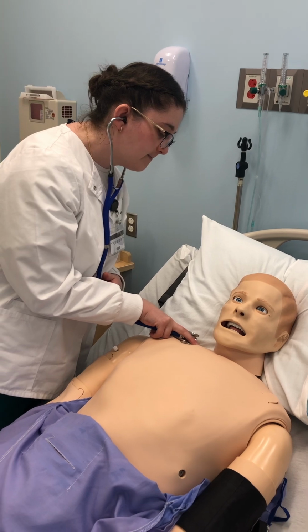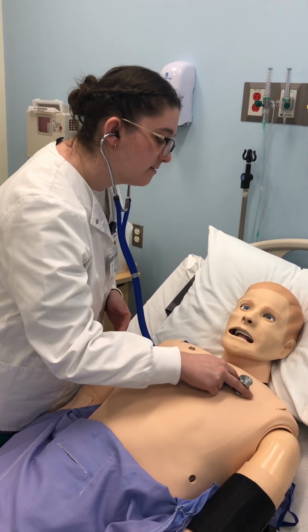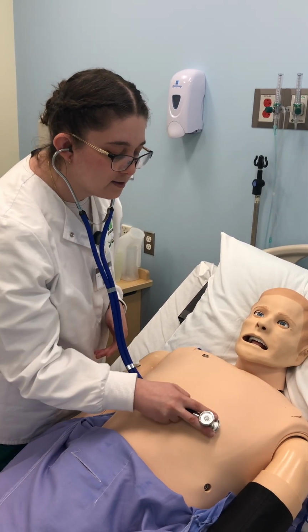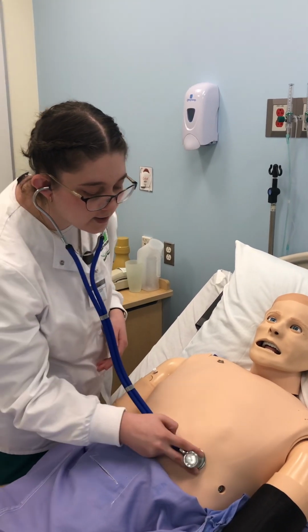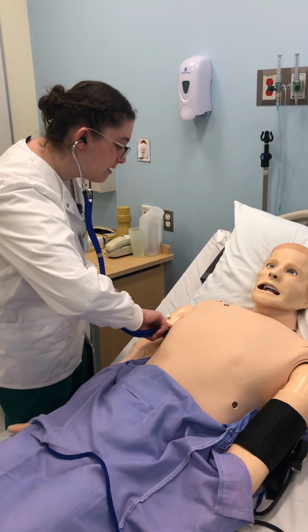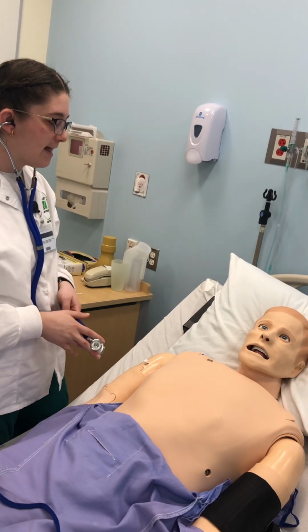Take a deep breath. Good. I'll move across. Good. Move down. Good. Across. Down. Across. Down. Across. Down. Across. And laterally. Alright, lung sounds were clear anteriorly, posteriorly, and laterally.